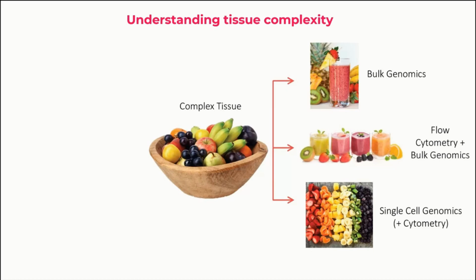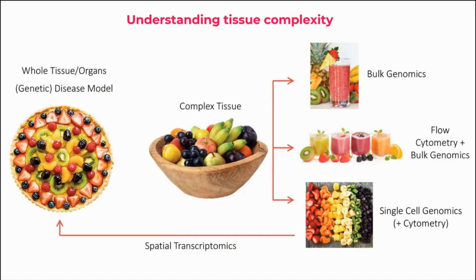And so what's happened in the last couple of years is we've moved into this spatial transcriptomics, spatial proteomics space, where we're able to profile the entire tumor without having to dissociate or mash these tissues up. We can see the disease for where it is in the body, we can see it on the organ itself, and we can see how those individual cells are not only composed, how many are there, but where are they, how are they talking to each other, what are the neighborhoods, what are the cellular communications that are going on.